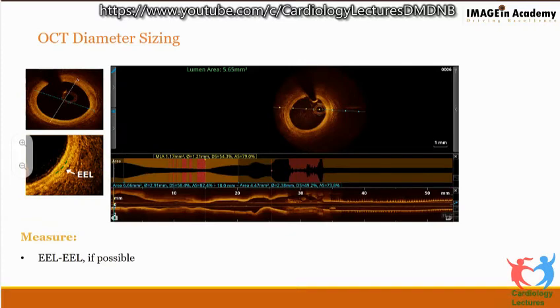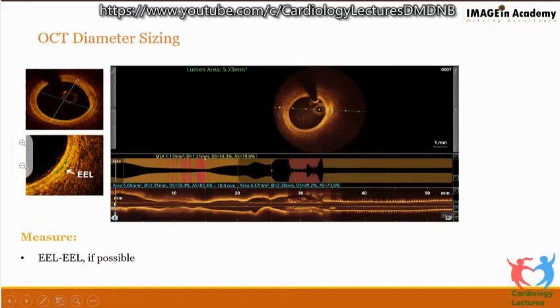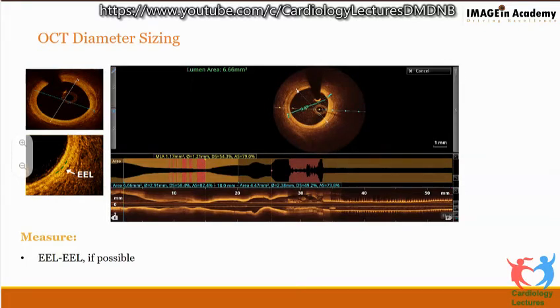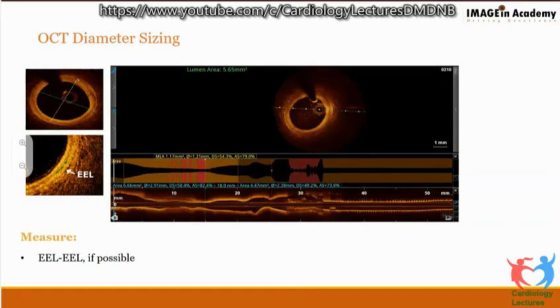Now, while marking the distal reference here, what you can see is that we've used EEL in this case. So we'll select the point where we are able to identify the structure. We go to the left right corner, select length, and measure from EEL to EEL. We have to take two cross-sectional cuts, a second cross-sectional cut being taken. And now you have these two dimensions. So we've already got the dimension, and we do the same thing for the proximal segment.